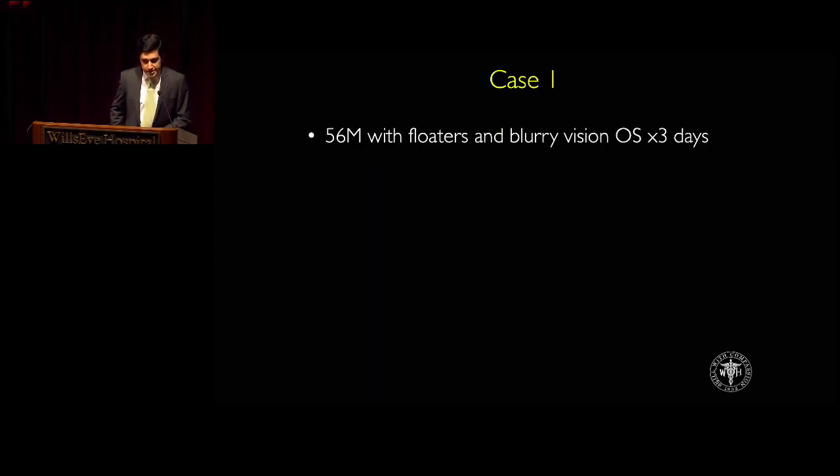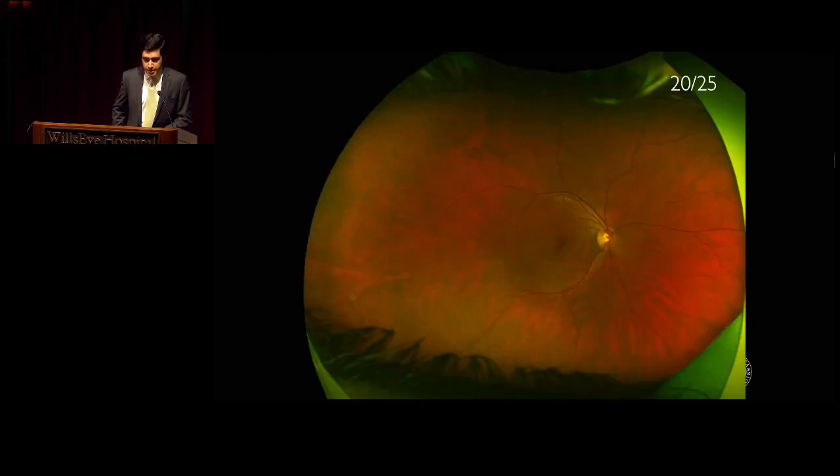Our first case is that of a 56-year-old gentleman presenting with floaters and blurry vision in the left eye for approximately 3 days. Dr. Light, could you walk us through this case?